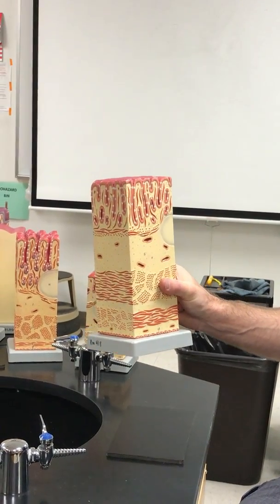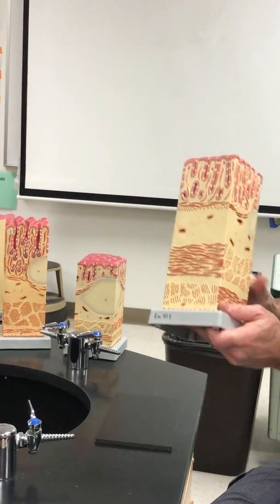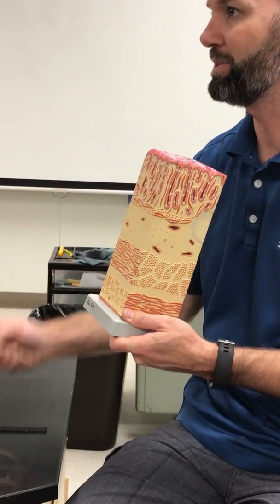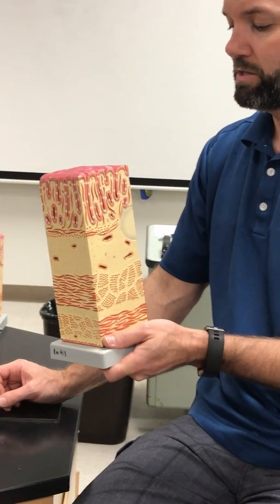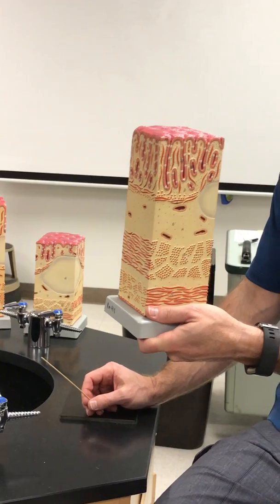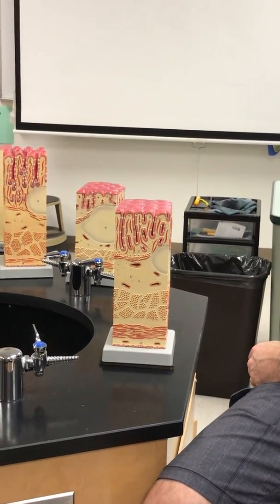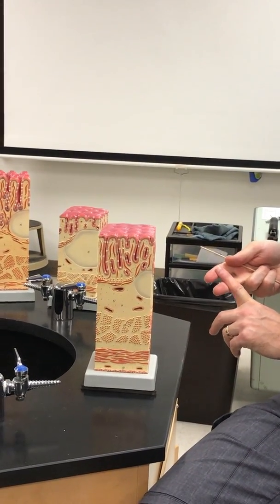Simple columnar, so that rules out esophagus. At the very bottom, simple squamous epithelium. That's part of serosa, although what's the name of the epithelium itself? Mesothelium. So because there's a serosa, that's going to rule out what? So anything above the stomach, it can't be esophagus or anything higher. There's no serosa up there. It can't be duodenum. It can't be descending or ascending colon.